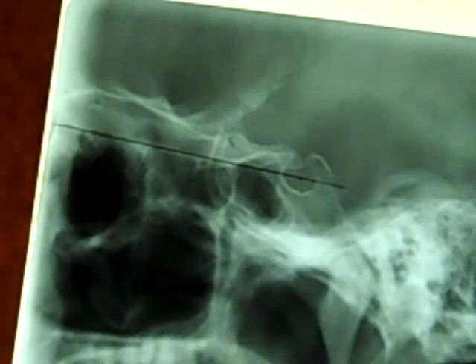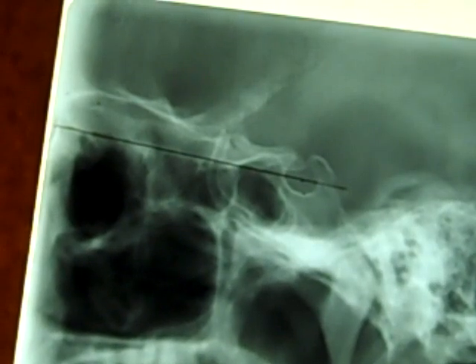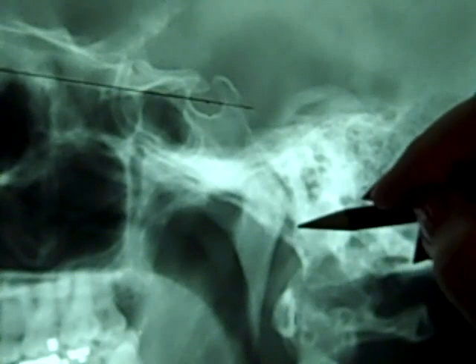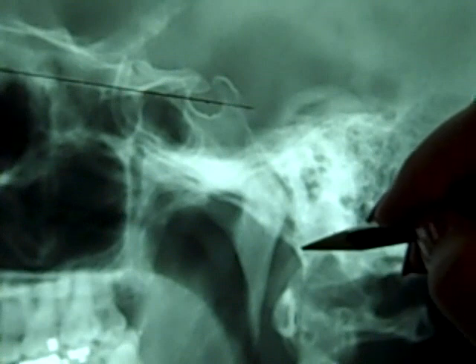The next line is to find the front, or anterior portion, of the foramen magnum. I'm checking my film because I'm going to move the camera again, so hold on to your seat. I'm going to move this down just a little bit because the anterior portion of the foramen magnum gives some people a difficult time. We know where the ADI is, and if you go straight north of the ADI, you'll usually find a sideways V of white density. Remember, periosteum shows up a little bit whiter than the inside of bony tissue. So right here is my V shape: increased white density north of the ADI.